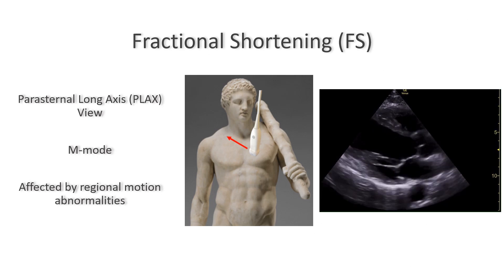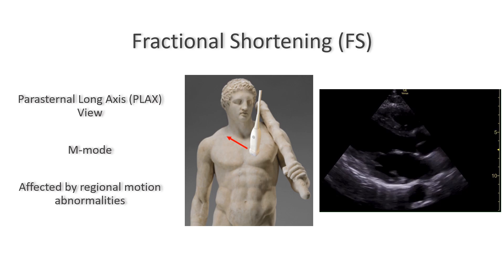The fractional shortening is measured at the parasternal long axis view. You can also use the parasternal short axis view to measure it, but in this presentation we'll just use the parasternal long axis view. You will also need M-mode on your echo, and if you have an anatomic M-mode as an option on your ultrasound that's even better, to eliminate error if you're cutting the ventricle at an angle.